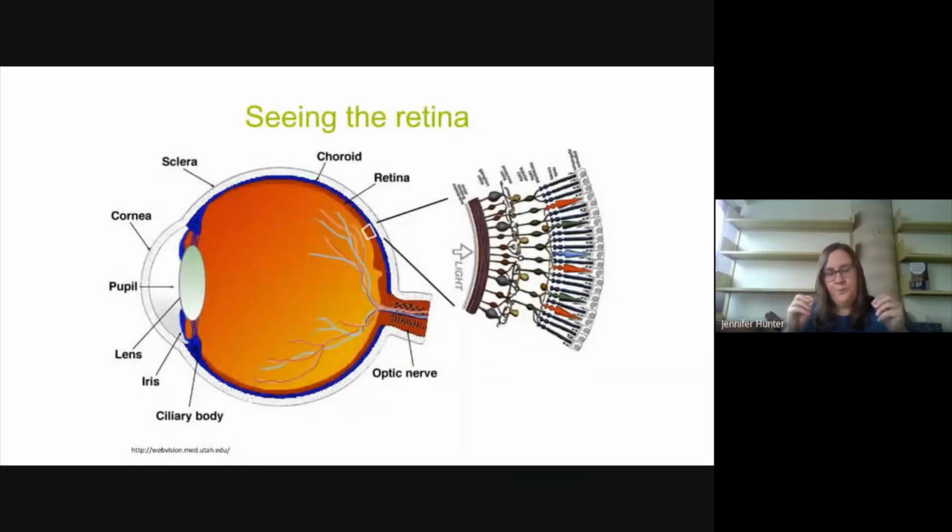And so as we probe into the retina, in order to look at the retina in a living eye, obviously we can't take it out and put it in a dish and look at it under a microscope, which would give us beautiful quality, high resolution images, but it only gives us one snapshot in time, and it wouldn't be very good for patients. So we use the optics of the eye to image the back of the retina.